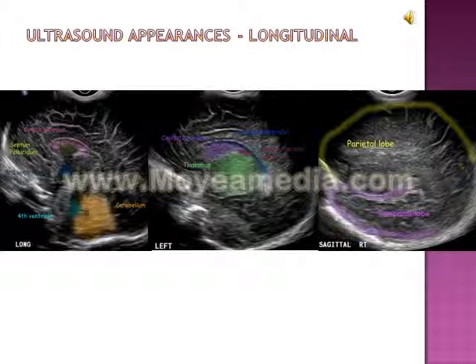As we angle parasagittally, the shape of the lateral ventricle, shown in blue, is the key landmark for this view. The caudate nucleus in purple lies below the floor of the frontal horn of the lateral ventricles. The thalamus in green lies behind and below it. The occipital horn of the lateral ventricle is filled with choroid plexus. The choroid tucks up in the caudothalamic groove in the floor of the lateral ventricle and may be echogenic. Further angulation of the transducer laterally results in a section lateral to the lateral ventricles. The Sylvian fissure is the key landmark in this view. In very premature infants, the brain sulci are not fully developed and the brain appears quite smooth.